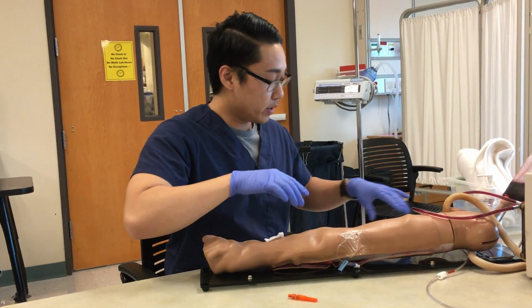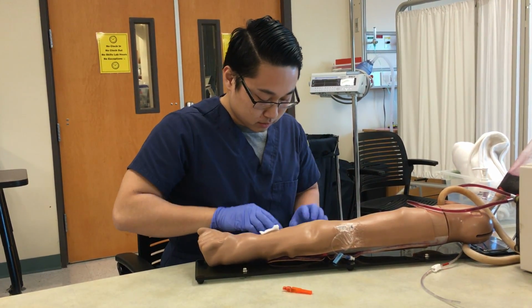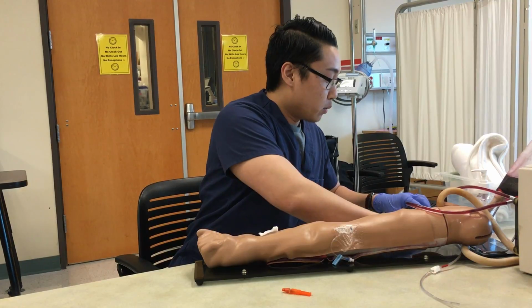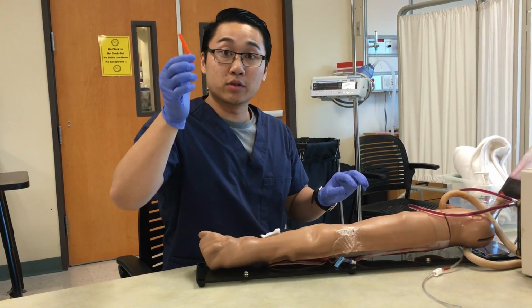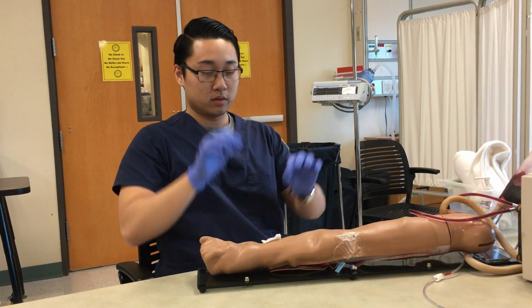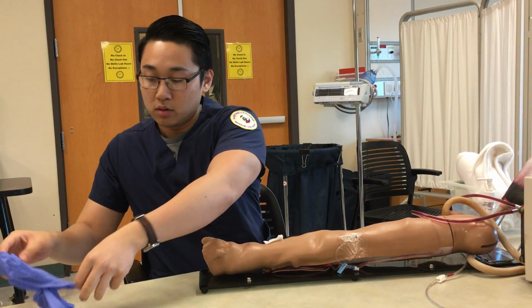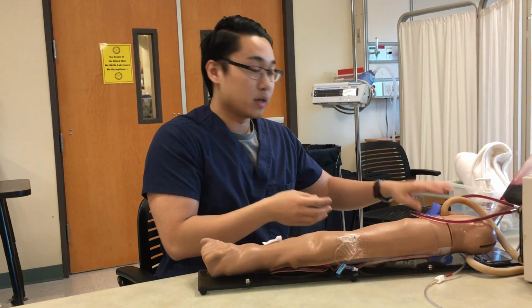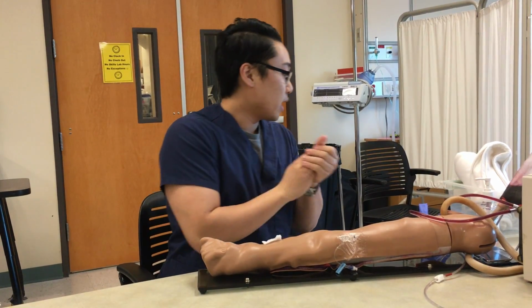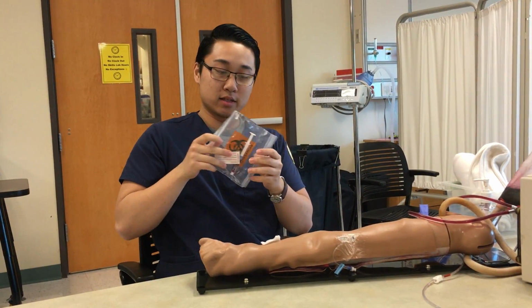I'm going to clean up my area, get this stuff away, and I will dispose of the needle into the sharps container. Take off my gloves, toss this away too, and I'll wash my hands, and I will make arrangements to go test this arterial blood gas.